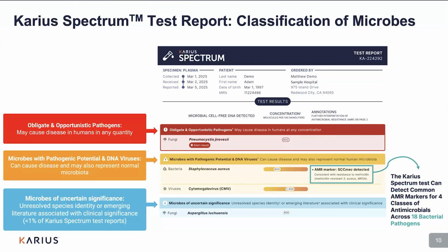They occasionally might be, but usually subject to case reports. And they account for less than 1% of the pathogens that Karius reports. But because they're not that common, they can be frequently contaminants. They require a very careful interpretation in context with the clinical syndrome.